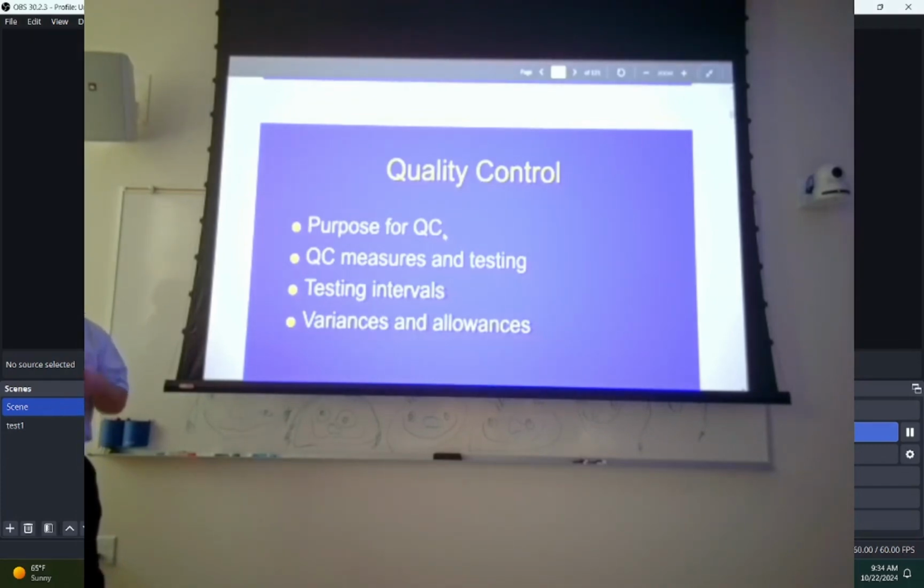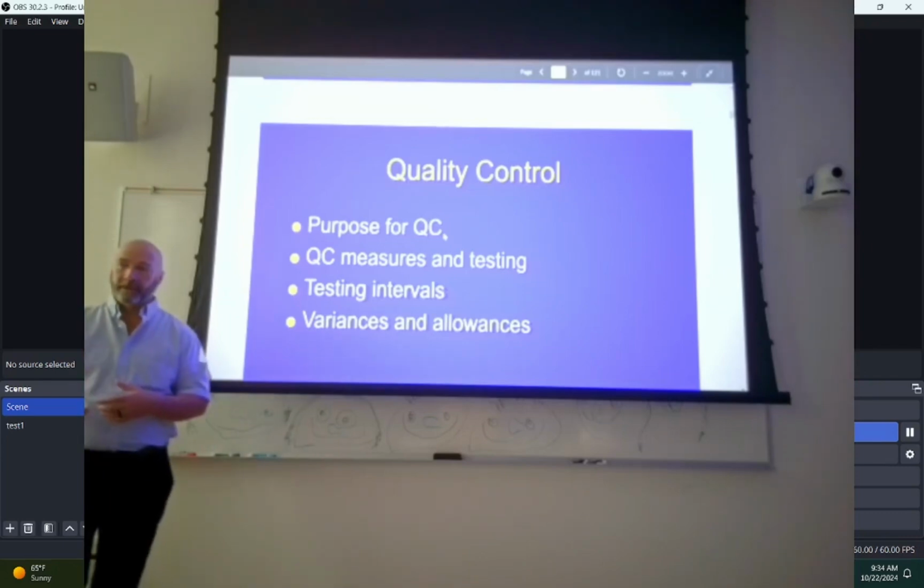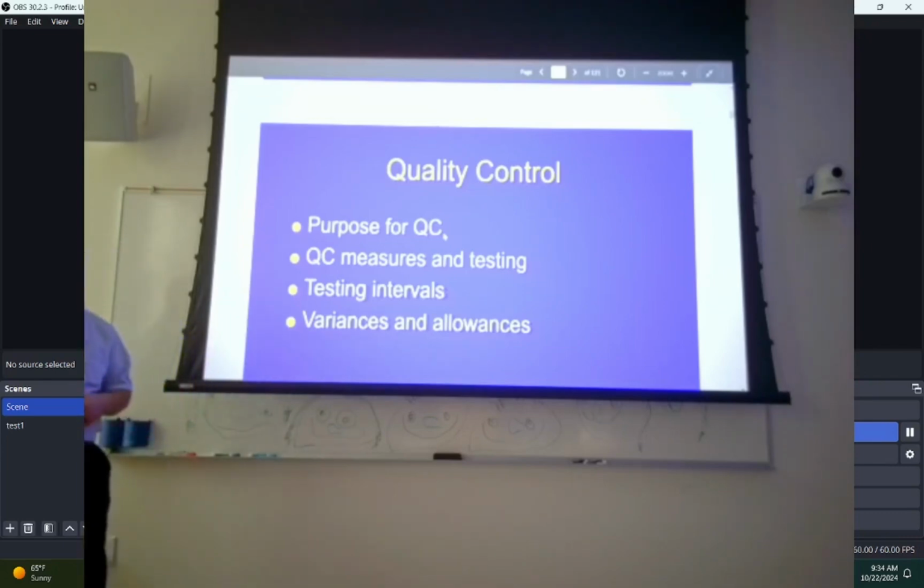And at the same time, they have to test half value layer. They have to test everything to make sure that the output from the X-ray tube is reflective of what it should be to make an image on living tissue, right? So that's an ongoing process. As long as you own that machine, every year a physicist is supposed to come in and test all that stuff. And we do have physicists come in and test our stuff, but it's not as frequently as what it should be in the hospital, because we're not set up to shoot people.